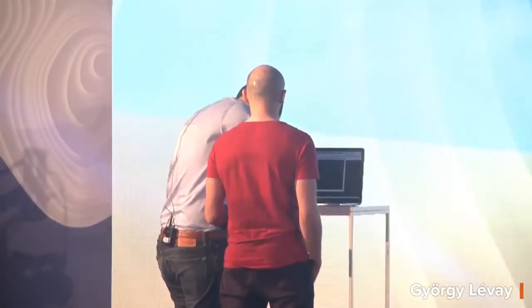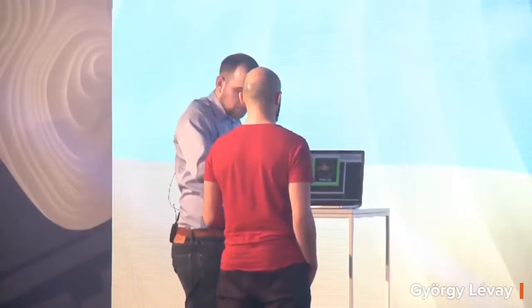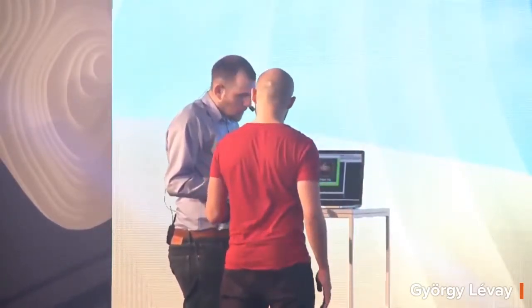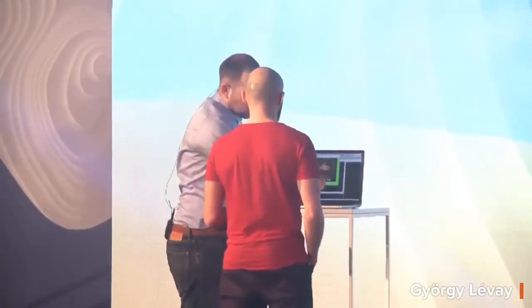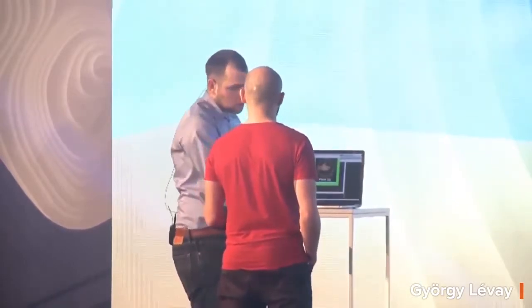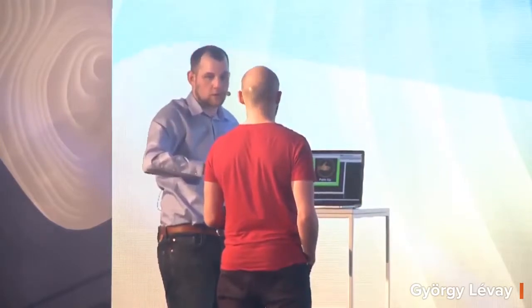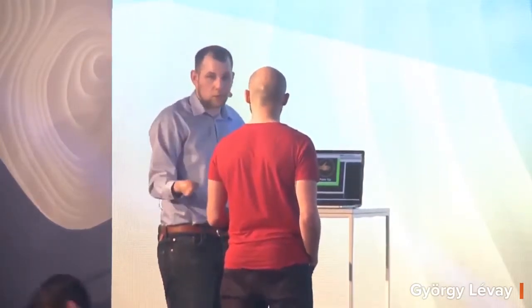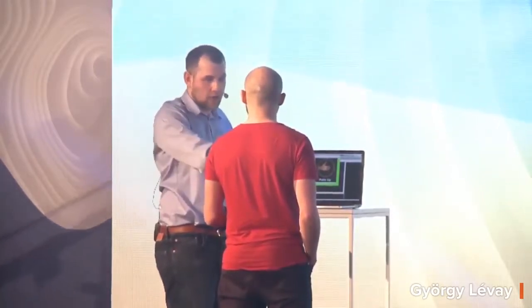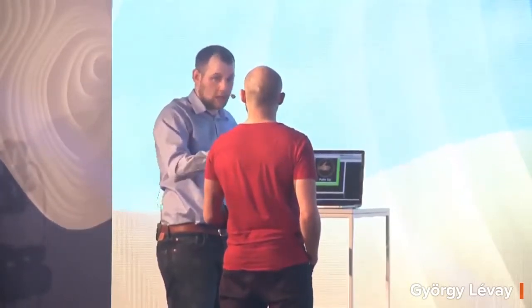Okay, so I'm going to press the button and it's going to start. Palm up is when you're rotating your wrist. So always when there's an open, I should stretch out? No, so the things are going to be written on the screen. So if you have, for instance, a palm up, you don't do anything with your fingers, you just rotate your wrist. If you have a palm down, again, you just rotate your wrist. If you have wrist flexion, extension, adjust the wrist. But when you have a close or open, you do just the fingers and the hand and not the wrist.